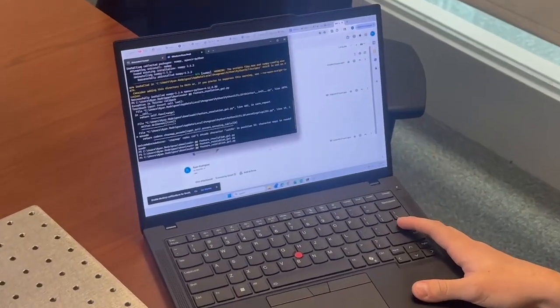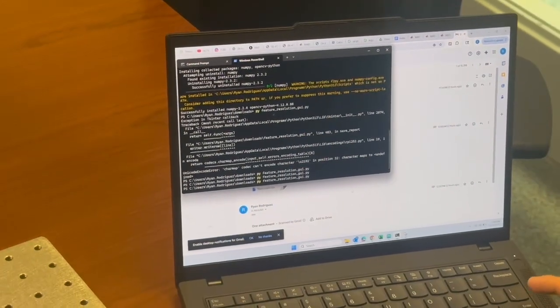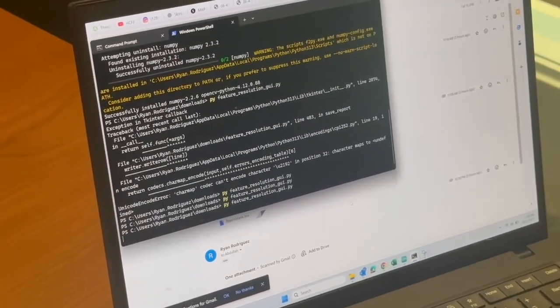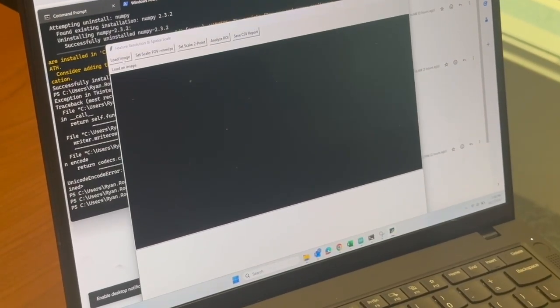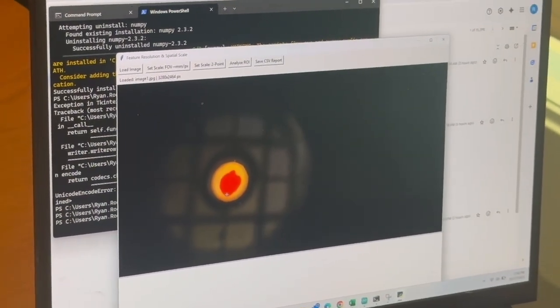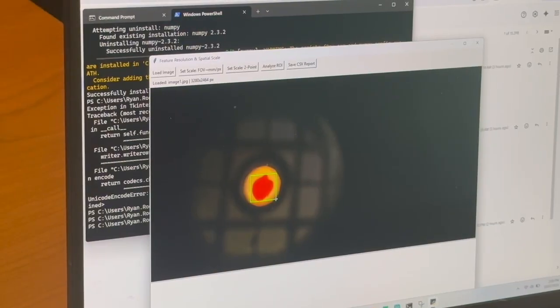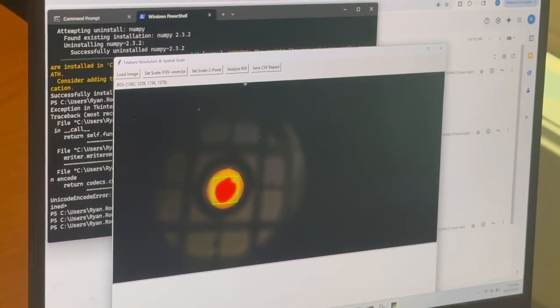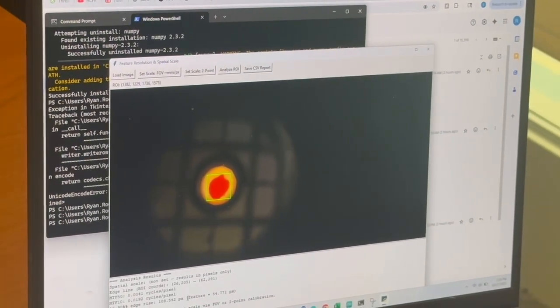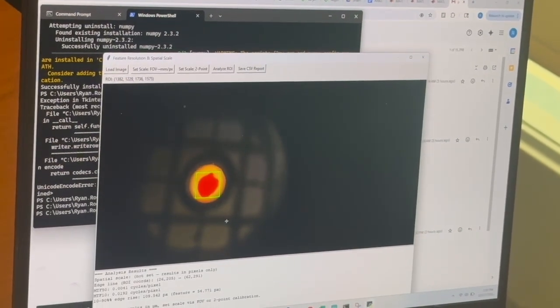So now I'm going to be going over the last two demoable specs. The next one is our feature resolution and spatial resolution. So basically what I have done is taken a bunch of sample images and I'm using a quick Python GUI that will load an image from my computer that we have previously taken. See, this is an image we've previously taken, and then I can draw a box around the region of interest and analyze, and it gives me the amount of pixels that the region covers and the feature size, as well as the spatial resolution, which allows us to collect data and other things on our system.